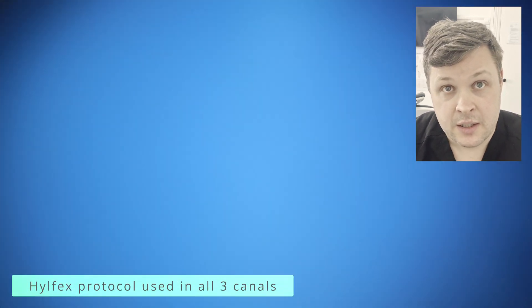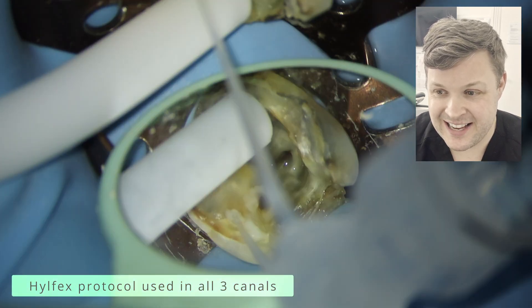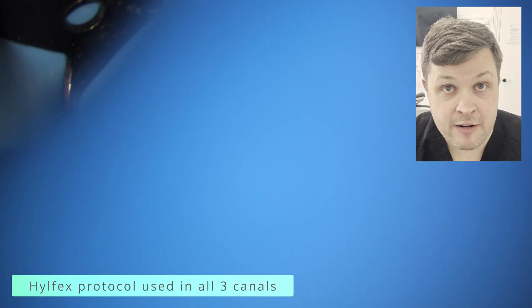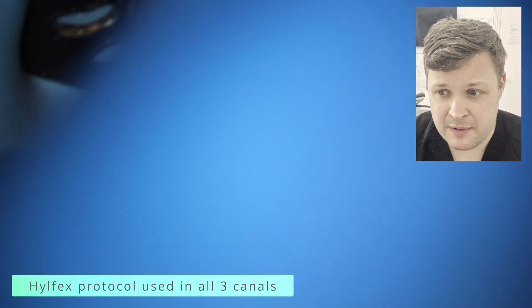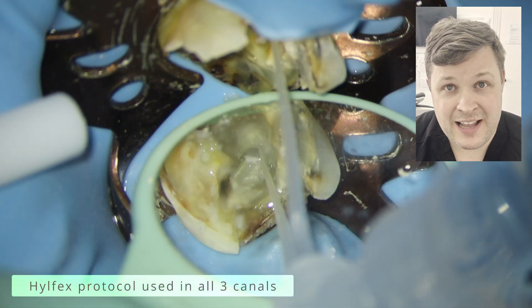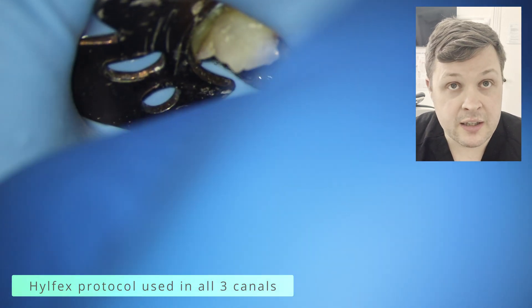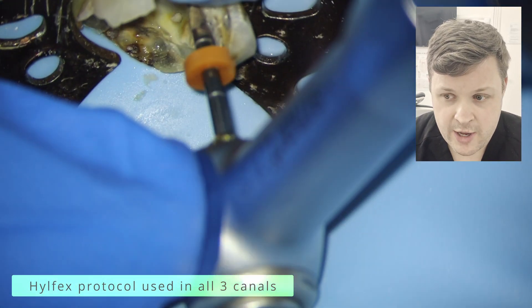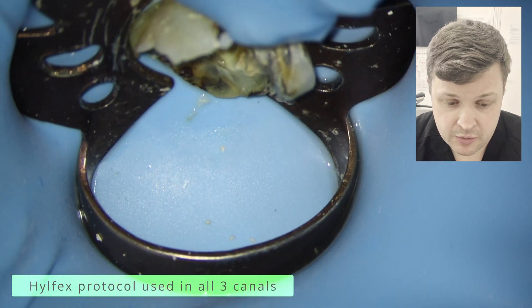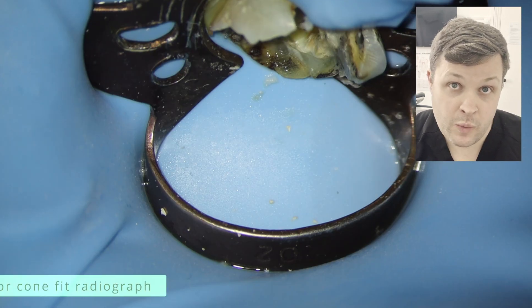With my protocol, as you'll know from many of my videos, I like to use HyFlex and I use a size 15/04 glide path file in all the canals. I like to use D-finders — the size 10 D-finders — with lots of irrigation, and I'm using the HyFlex 25 variable taper. Some people think the size 25 variable taper is a little bit too big — the ethos at the moment in endodontics is to use narrow tapered files to preserve tissue — but I feel like the HyFlex is a nice balance between creating a wide enough prep for easy obturation while conserving tooth tissue. I'm definitely not using a WaveOne Gold 45 Large.